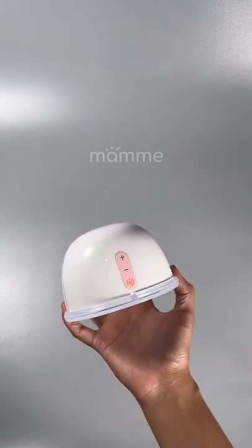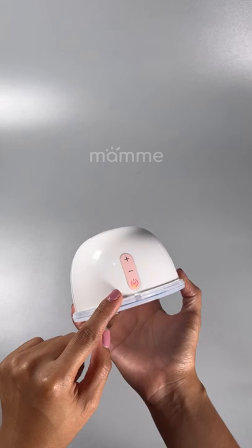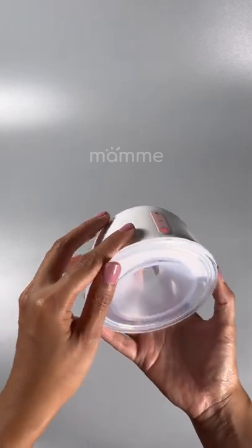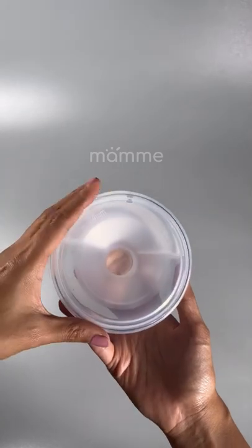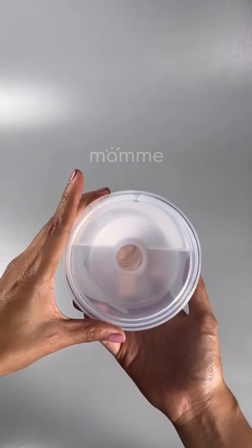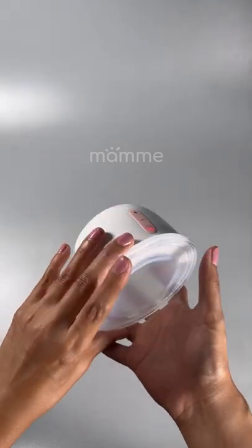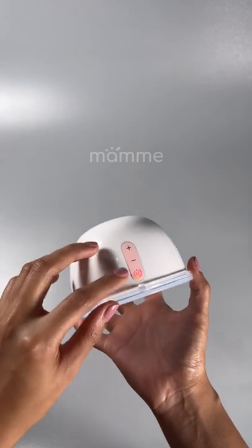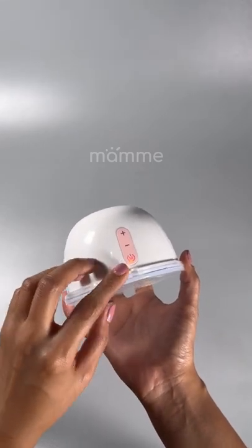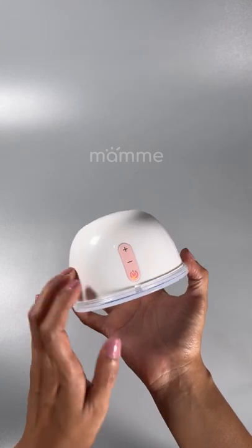Ayan. Nasa red siya, diba? Ang ibig sabihin ng red is that we are in massage mode. Ang massage mode, ang ibig sabihin niya, ganyan ang itsura, mabagal ang suction. Ayan. So, the suction is about 75 to 200 mmHg. Let me check that one later on. I will check the mmHg. But, if you are in massage mode, ito yung ginagamit mo para mag-trigger ng milk letdown.